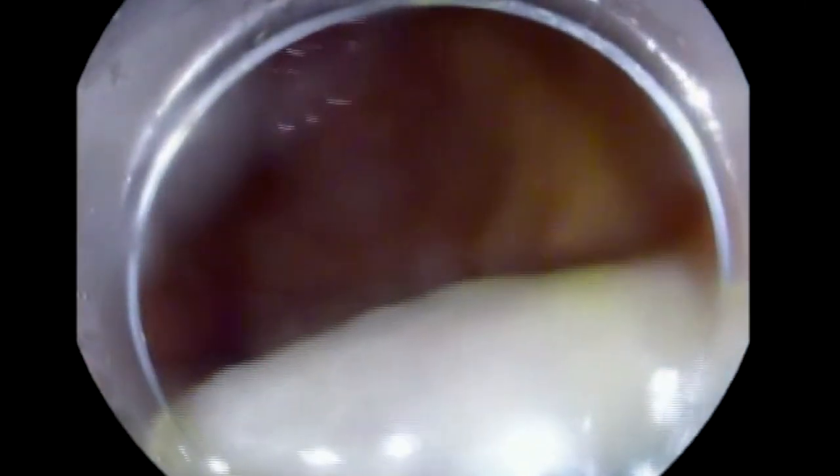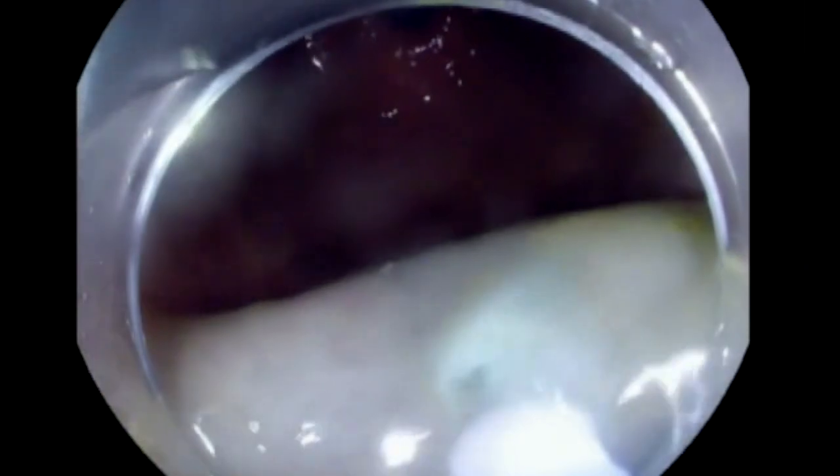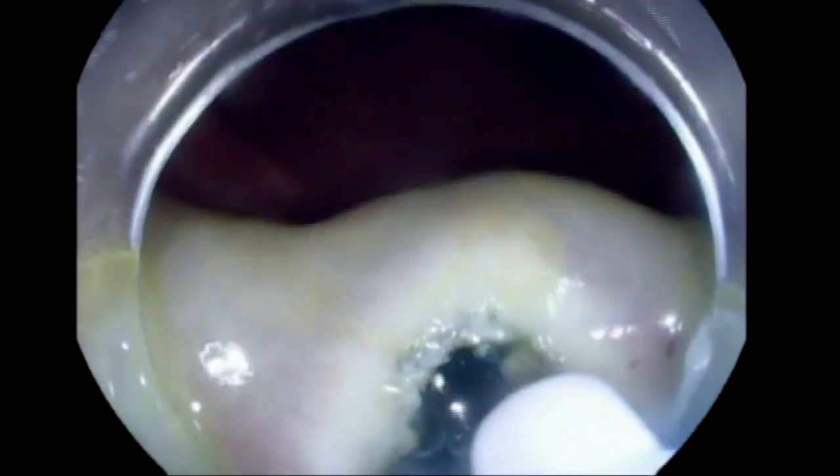G-POEM is almost similar to POEM. You have to do a mucosal entry, then go through the tunnel until you reach the pylorus, and then cut the muscle. Our mucosal entry is 7 cm from the pylorus, and we'll try to do it in the posterior wall. The reason for that is, in case perforation happens, it is a retroperitoneal perforation rather than a peritoneal perforation.